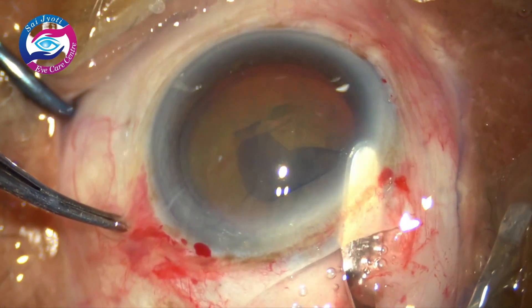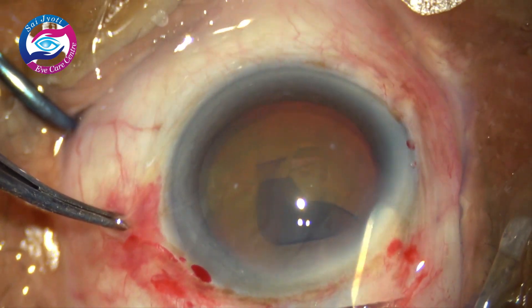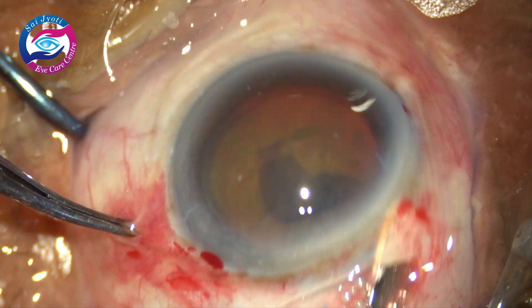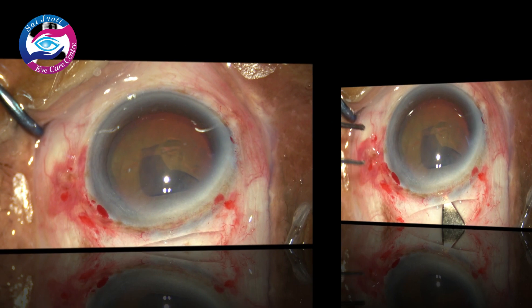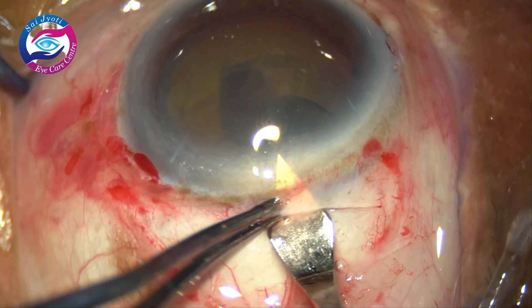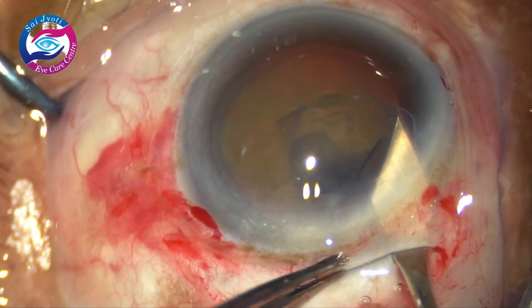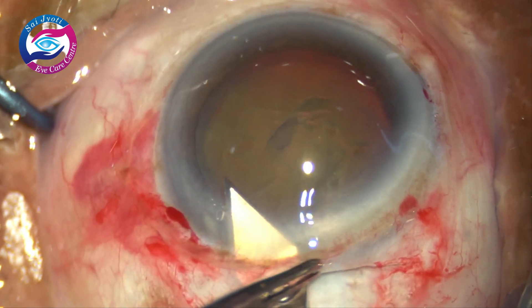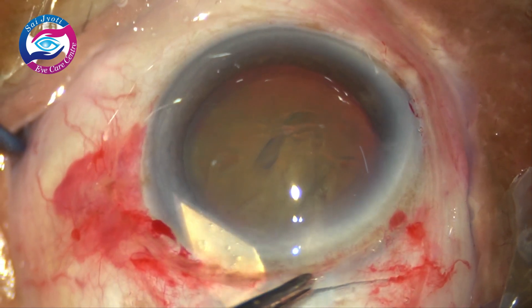The tunnel is extended sideways. The point to note here is that the inner lip of the scleral tunnel is wider than the outer lip. The blade should always be upwards — we won't have a premature entry and it has to be avoided at all times. Now is the time to enter the anterior chamber; the end of the scleral tunnel is marked, the blade is dimpled down slightly and the tunnel is enlarged. Always when you move forwards, cut the inner lip just to have a very smooth incision parallel to the limbus.